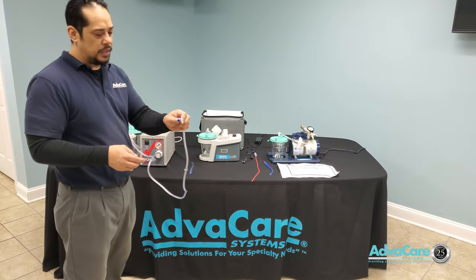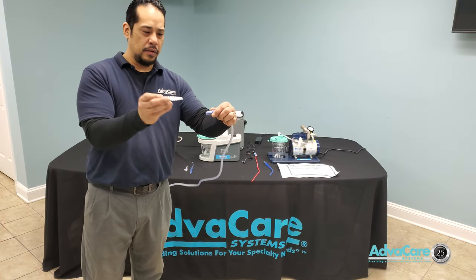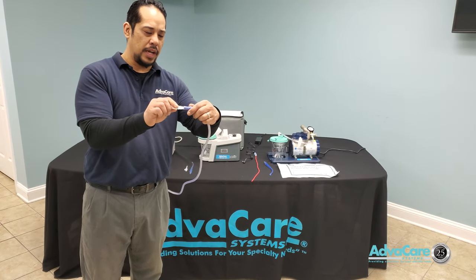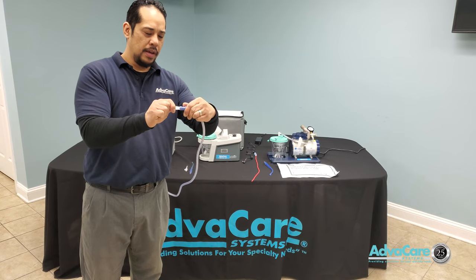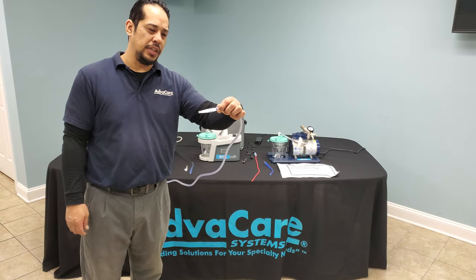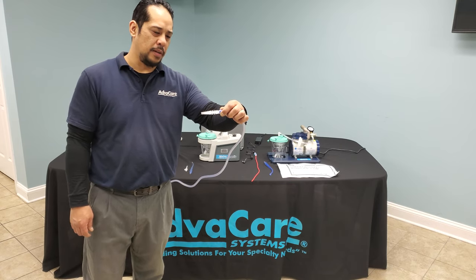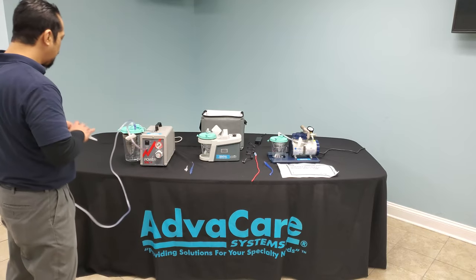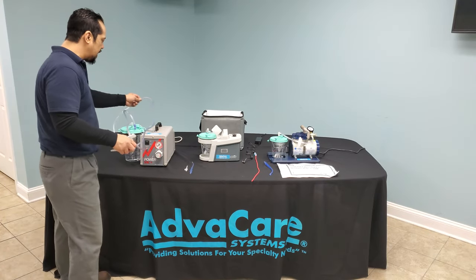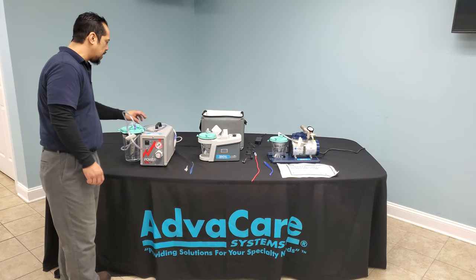Take the other side of the suction tubing and connect it to one end of your five-in-one connector. The opposite end would connect to the patient's G-tube or NG-tube. The reason for the intermittent setting is that you do not want continuous suction pressure applied to the G-tube or NG-tube any longer than needed.